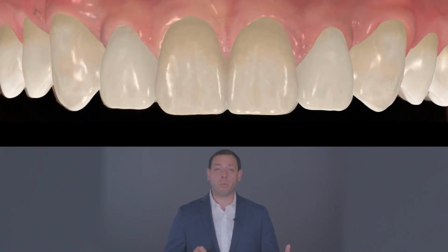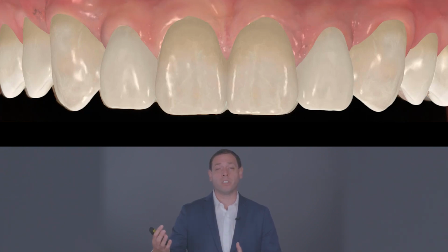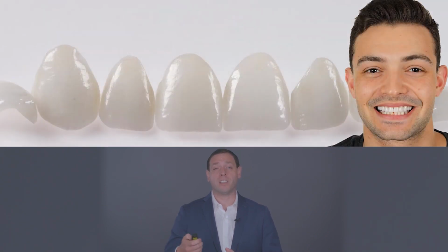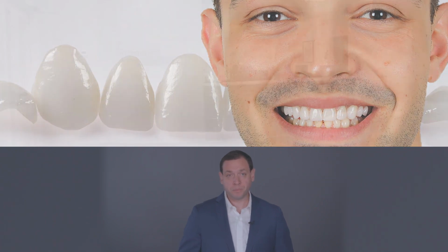Like the case we saw before, where we have this virtual wax up, this digital design that's patient specific, we can take that and transfer it to the patient's mouth. We can use this information to help dictate the design and the fabrication of the final restorations. And then we can deliver that to the patient, and we know that we're going to achieve something that is better than if we tried to do it with some of the older analog techniques in dentistry.